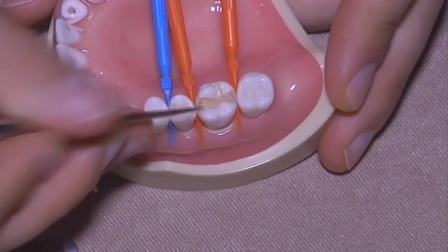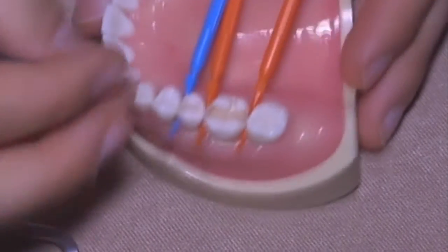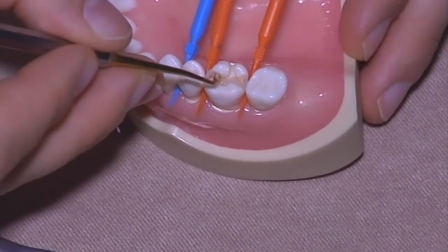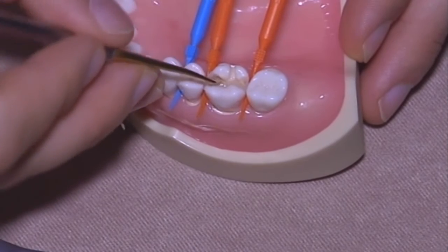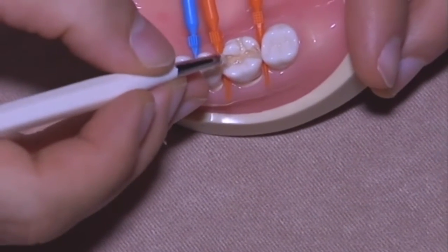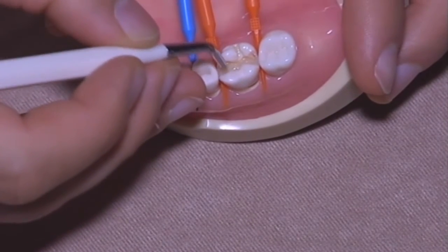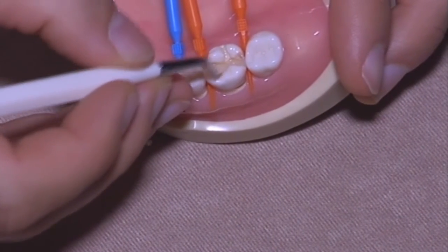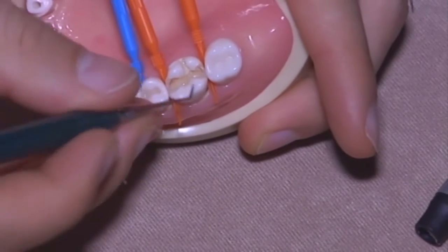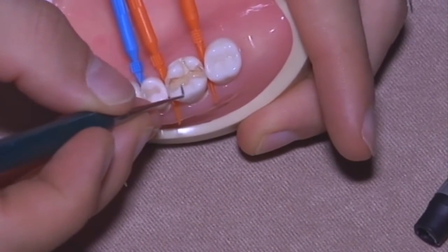So, adaptation. And also in the dentin layer, you start modeling everything, beginning to follow the anatomy of the tooth.